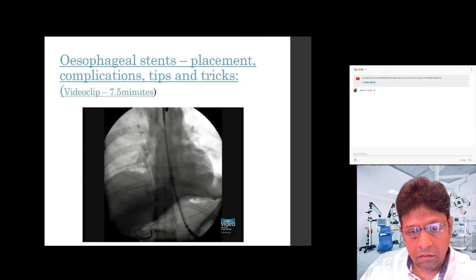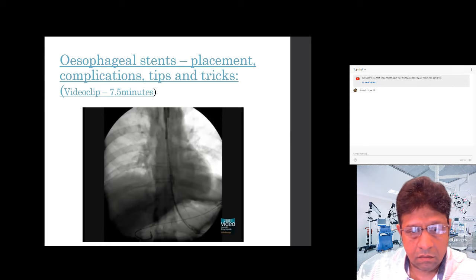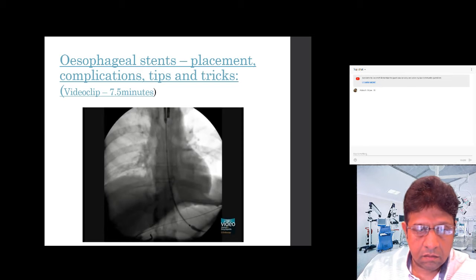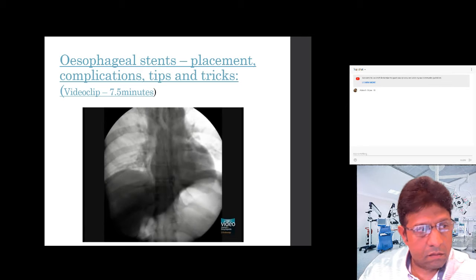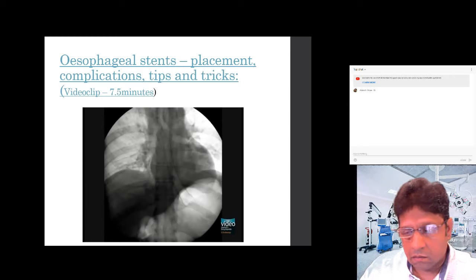In this patient, the stent is deployed in a distal to proximal manner, as is most commonly performed. The stent is fully deployed, clearly bridging the entire tumor. The delivery catheter and its guide wire are then removed from the patient, and the stent is left in place, bridging the entire tumor.